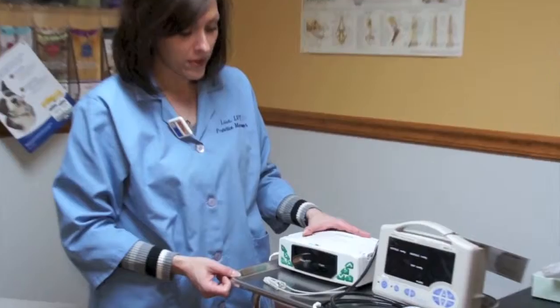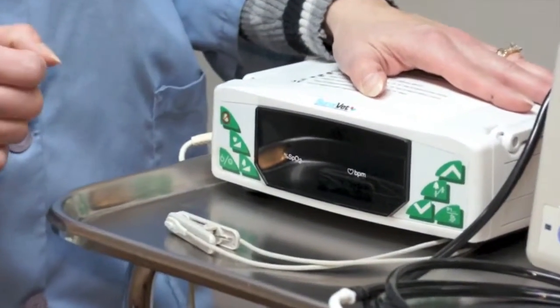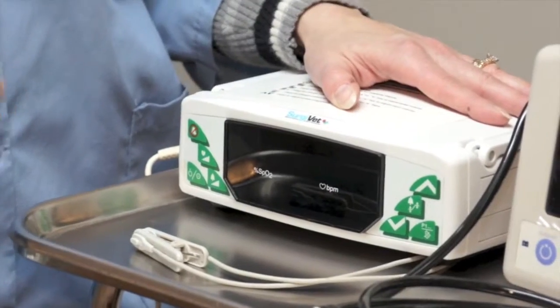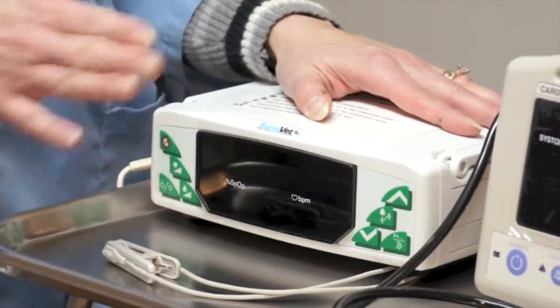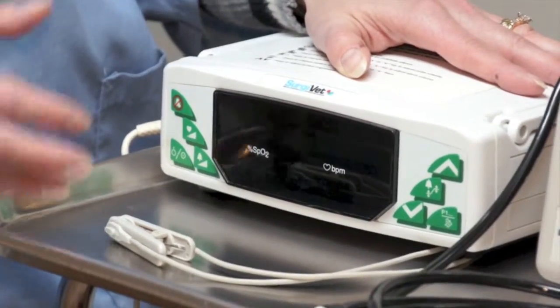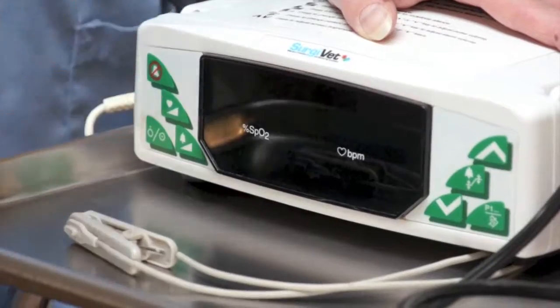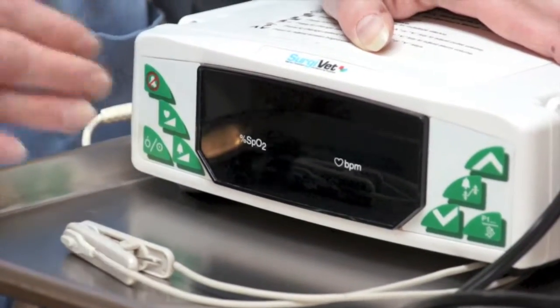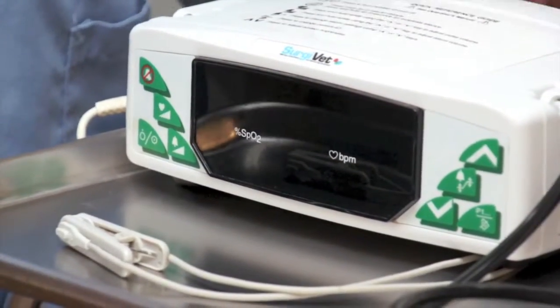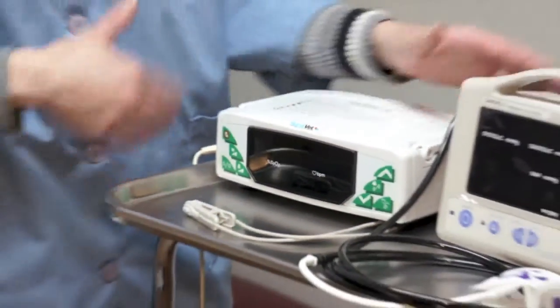Today, the one piece of equipment that we'll be using is what we call a pulse oximeter. The nice thing about this is that it checks the saturated oxygen level within our patient's bloodstream, more specifically the hemoglobin. And it also checks our patient's heart rate as well. Again, as a concern with any anesthetic, our patient's heart rate can drop, and this can also tell us specifically where their heart rate is at, that if we need to attend to them immediately for whatever reason, the monitors are there to assist us.